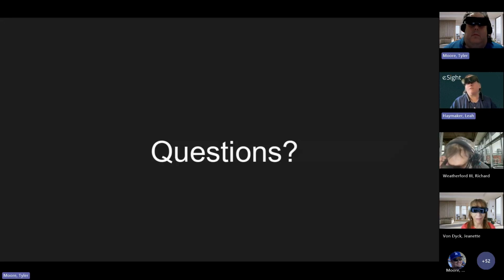And then also, real quick, to answer a question in the Q&A, to tell if your software update is completed, probably the easiest way is if you cycle through those modes and you get to volume and then your next mode is exposure, then it's updated successfully. If you're not sure and you just don't know, you can always go down in the menu selection.